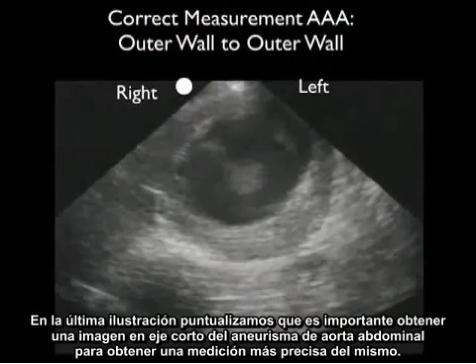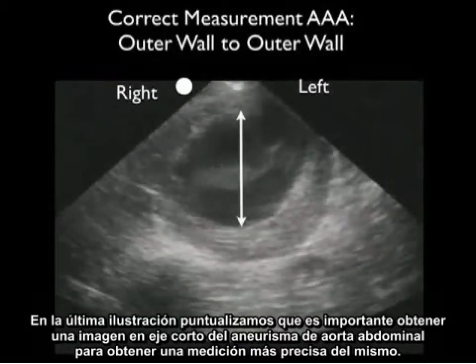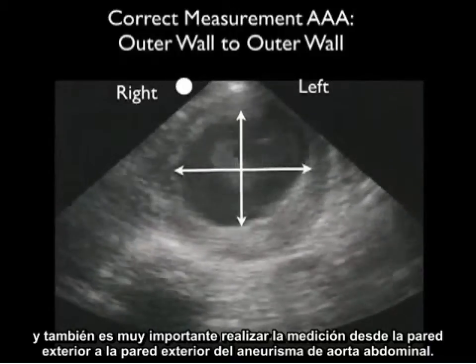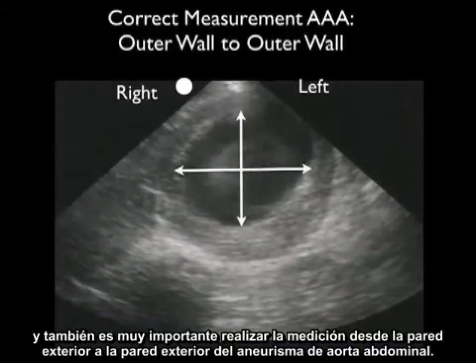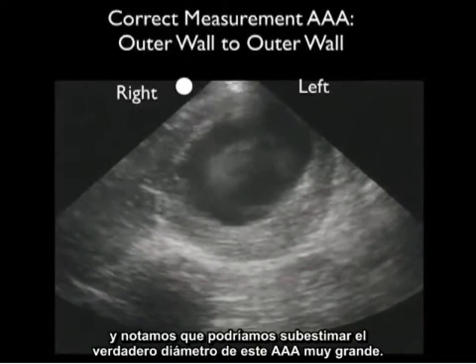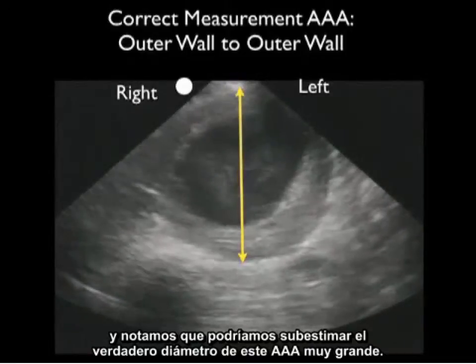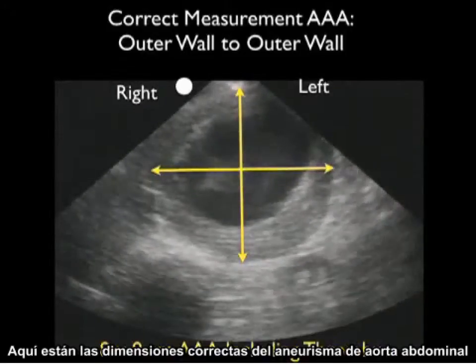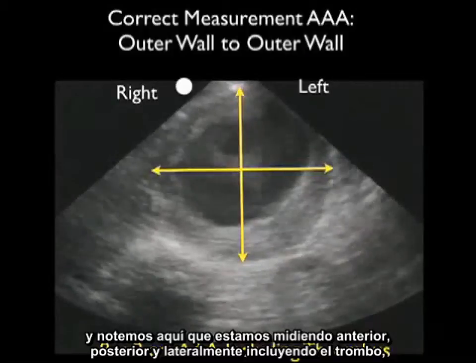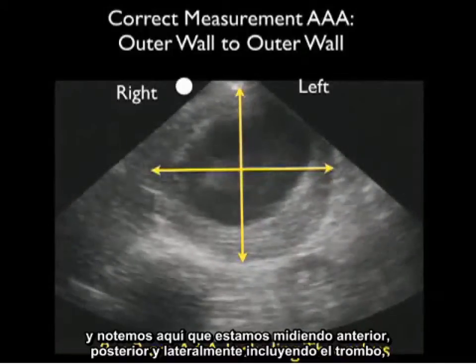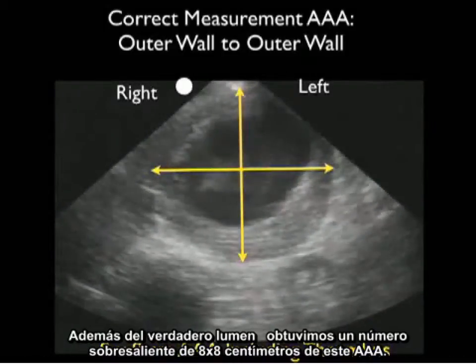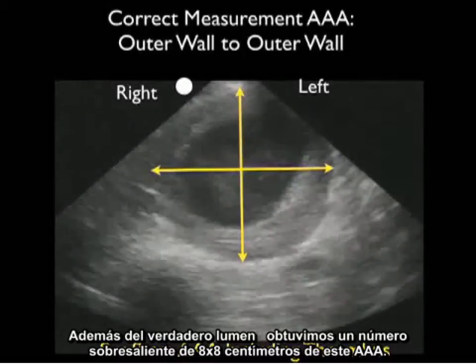It's important to image the AAA in the short axis configuration, but it's also critical to measure from outer wall to outer wall. Measuring only the inner lumen can vastly underestimate the true diameter. The correct method includes measuring anteriorly, posteriorly, and laterally, including the thrombus coating the outer walls in addition to the true lumen. Using this technique, we get an accurate measurement of 8 by 8 centimeters on this AAA.